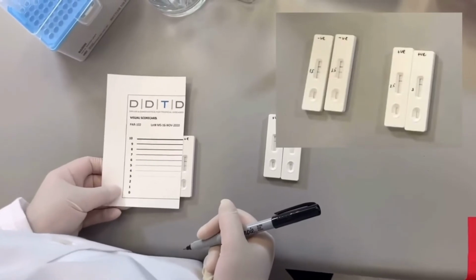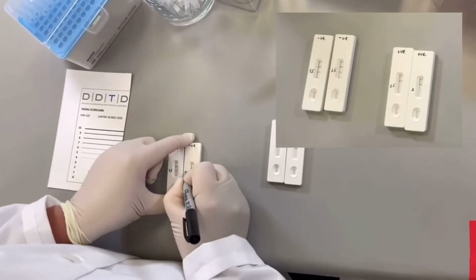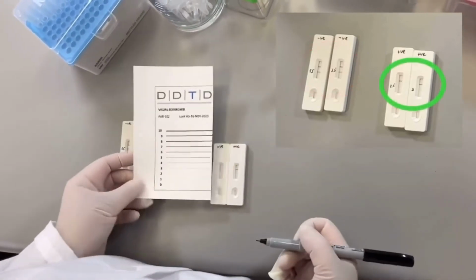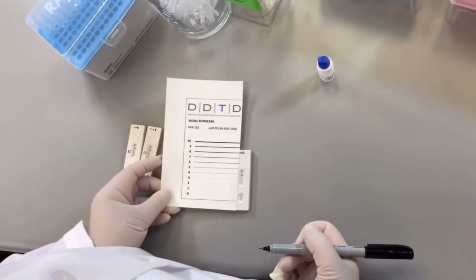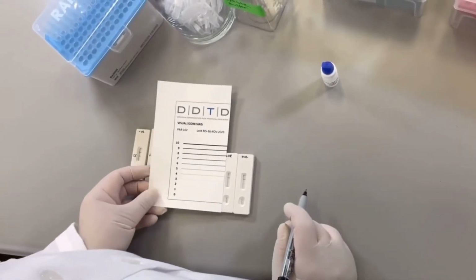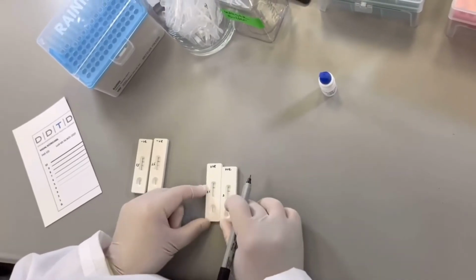Take a picture. As mentioned before, because of the competitive format, the assay produces a strong test line in the absence of mycolactone and a weak test line in the presence of mycolactone. In order to be considered positive, the test line intensity in the presence of mycolactone should be greater than or equal to 3 shades weaker than in the negative control.